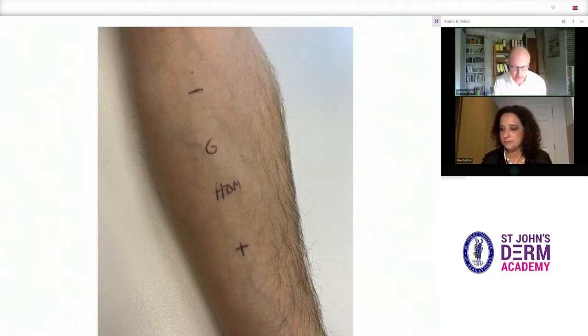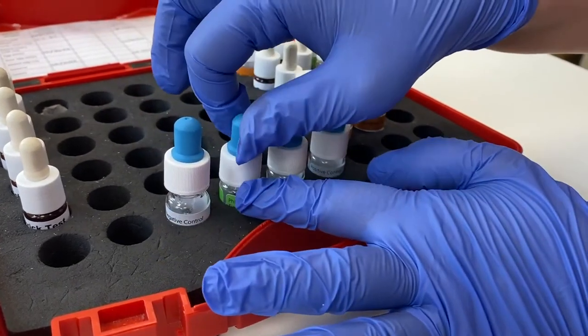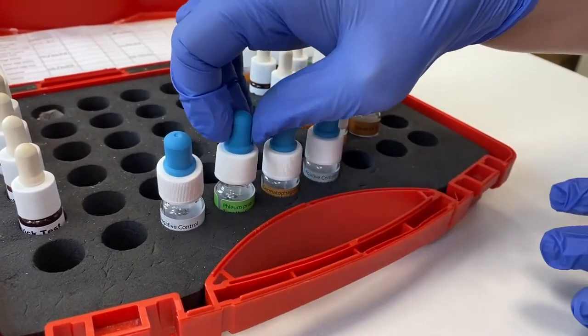The arm is marked up and ready to have the allergens dropped on. The arm should be in a flat, comfortable position so that the allergens do not run off or into each other. It is good practice to loosen all the bottles before starting, as that can be rather fiddly otherwise.